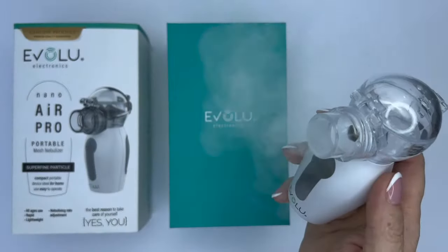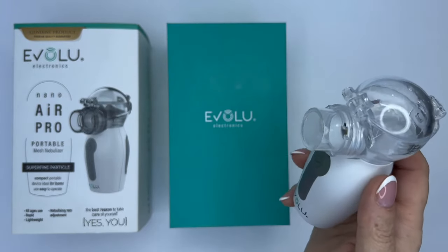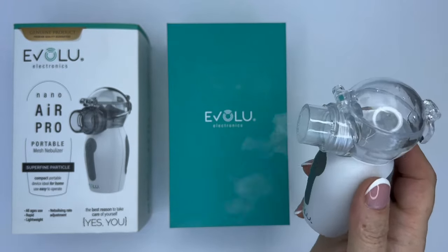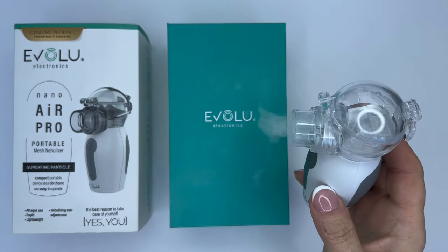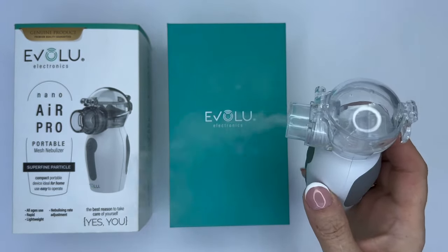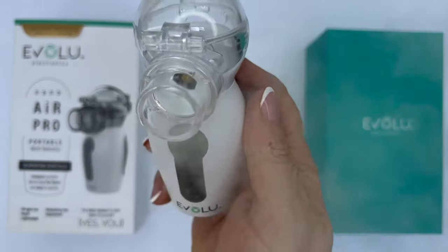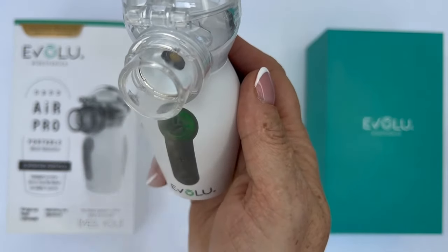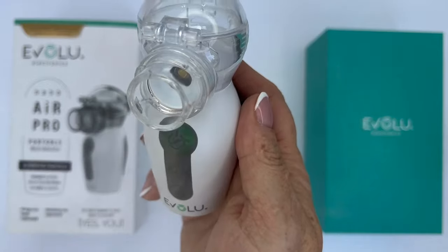It is important to stress that with the Evolu NanoAir, the use of essential oils, as well as medicines containing oils and sediments, plant extracts, cough syrups, lotions, and throat rinse solutions are prohibited. These additives are often viscous and can interfere with the functioning of the device or even cause damage.